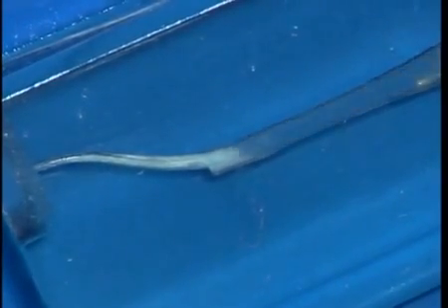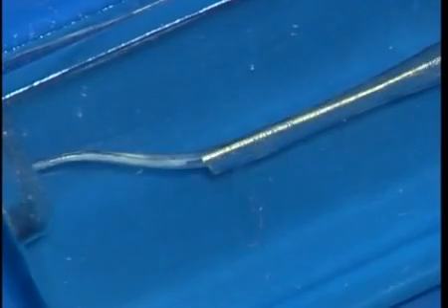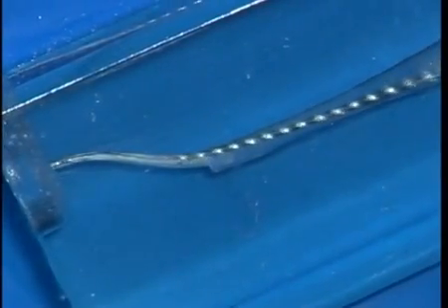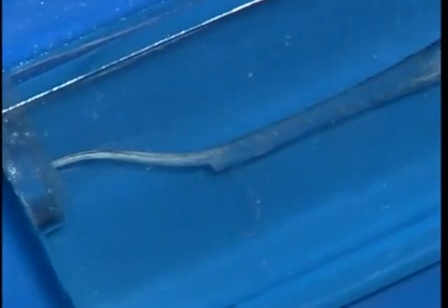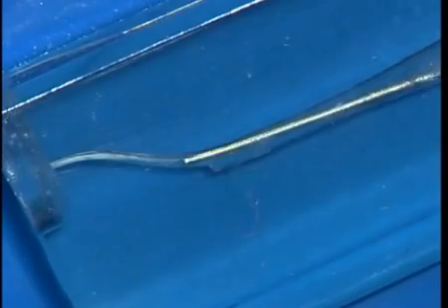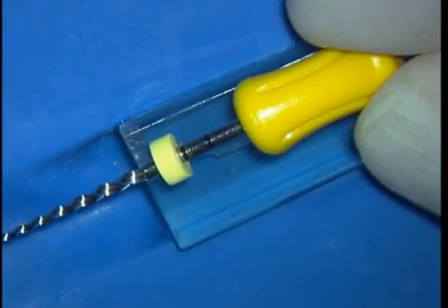Again, after its use, irrigate and recapitulate and re-irrigate. The recapitulation file again is used in little deliberate short amplitude strokes to move debris into solution so that when we re-irrigate, we can liberate that debris. The next sequential instrument is the ProTaper Finisher number 1.